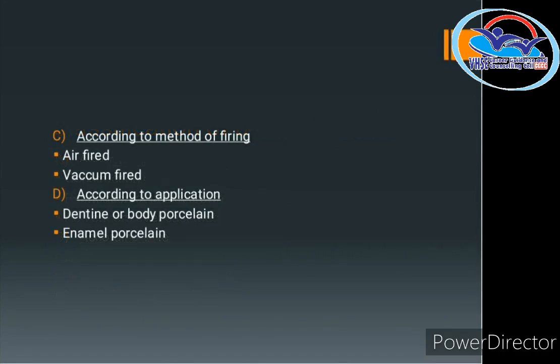Classified by method of firing, ceramic teeth can be air fired or vacuum fired. In terms of application, ceramics are used in dentine, body, and enamel layers.